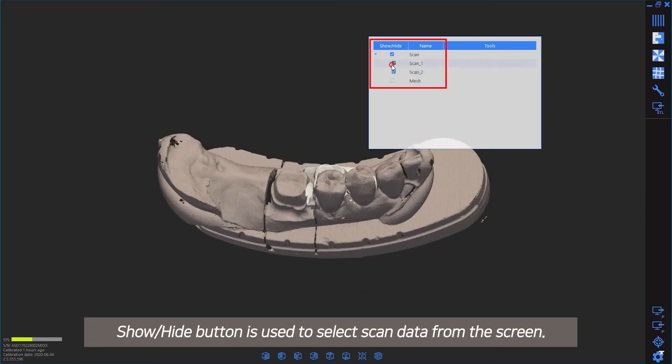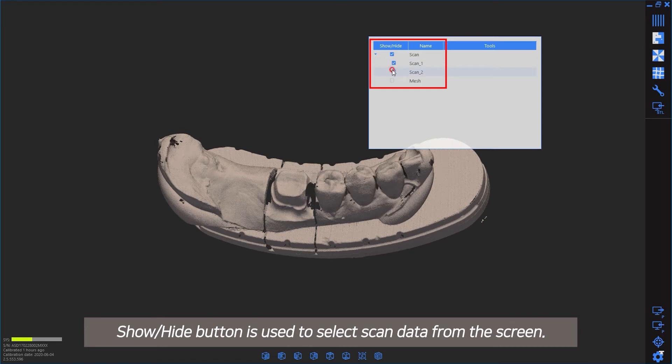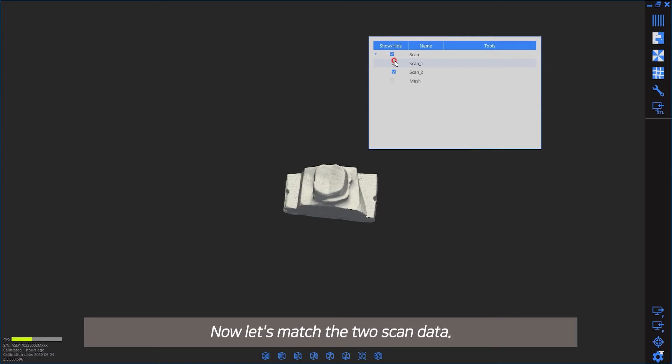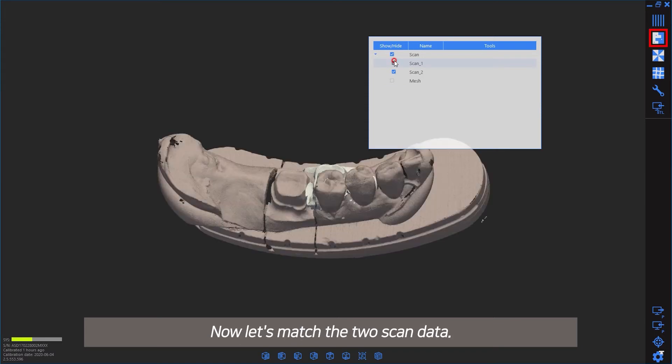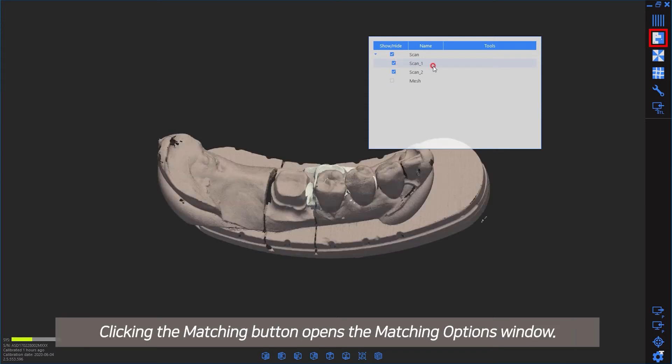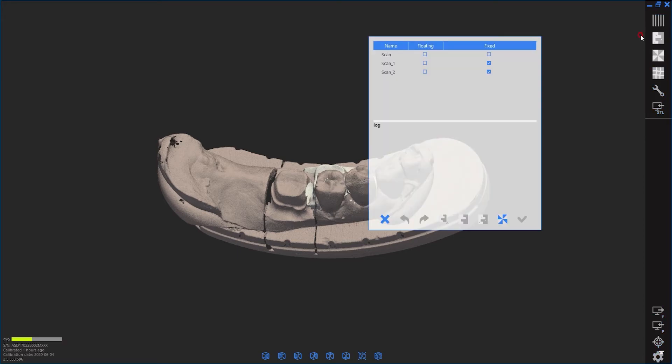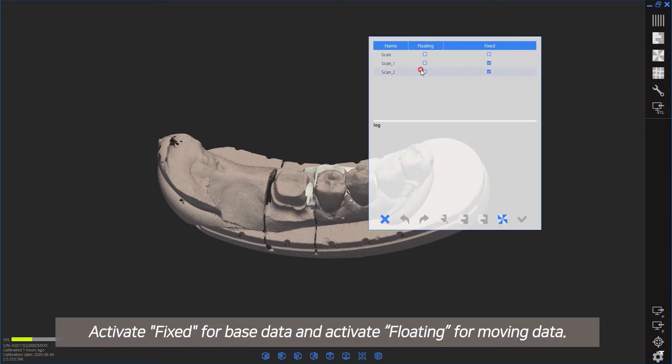The show/hide button is used to select scan data from the screen. Now let's match the two scan data sets. Clicking the matching button opens the matching options window. Activate for base data and activate for moving data.